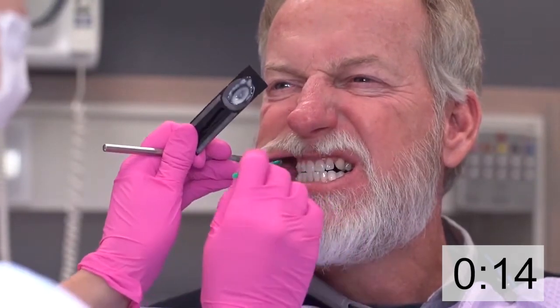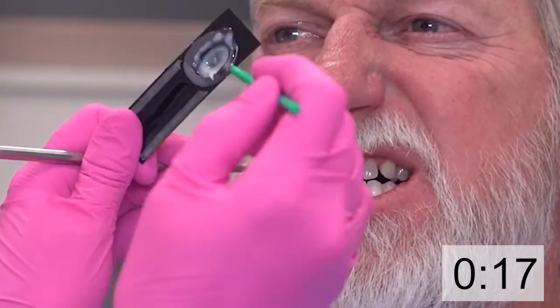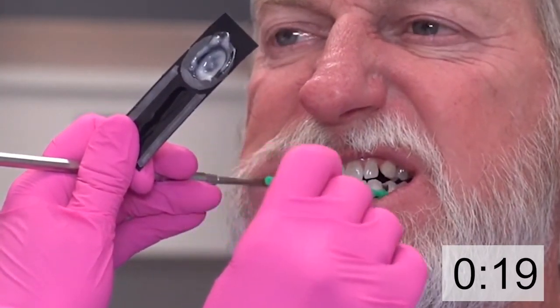Then I ask my patient to look straight ahead. I retract the left cheek, refill my applicator brush, and swipe across the maxillary arch on the left, then swipe across the mandibular arch on the left.